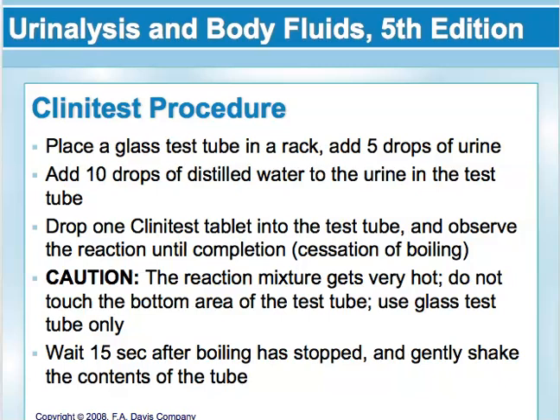Heat is produced by the hydrolysis of sodium hydroxide and its reaction with sodium citrate. Carbon dioxide is released from the sodium carbonate to prevent room air from interfering with the reduction reaction. So you'll actually see a bubbling or kind of a boiling reaction that's going on in the tube.